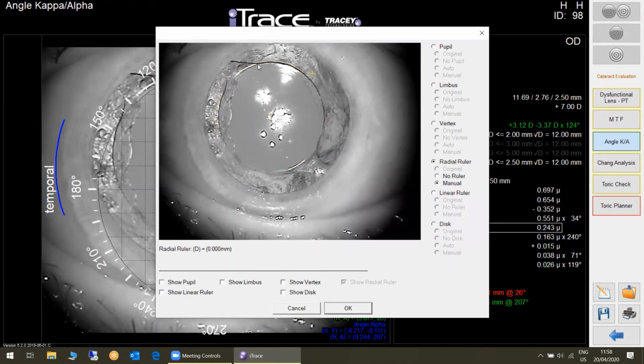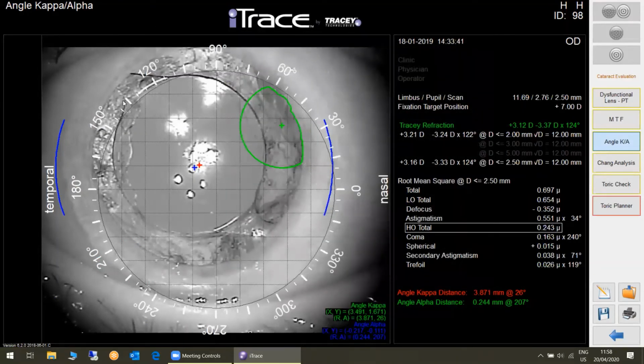Well, there's only one lens that I know of this size. This is a German lens from Dr. Schmidt, I think, of Human Optics. And then I see here, this is where the lens goes into the bag, here. And here it comes out again. Here it goes in the bag and out. Oh, so this is an optic capture.